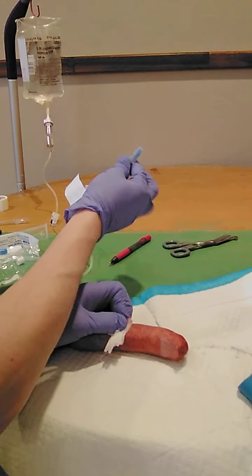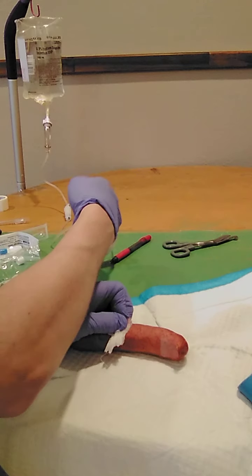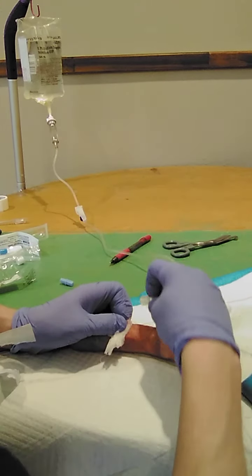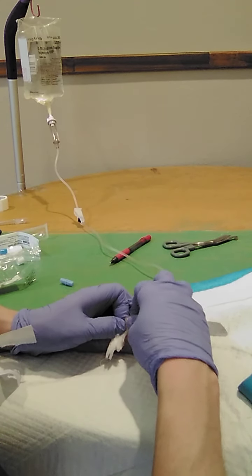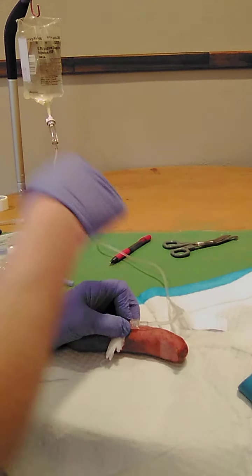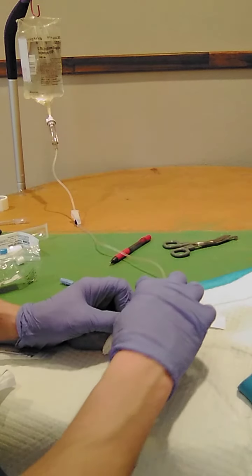And now, while maintaining sterility, I'm going to expose this hub. Seeing that I'm still primed, there's no air visible. Seeing the lock, securing the luer lock. I'm going to achieve my chevron, attaching this carefully to the patient's skin.